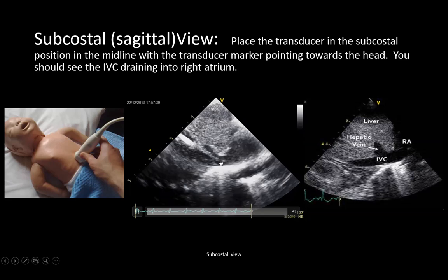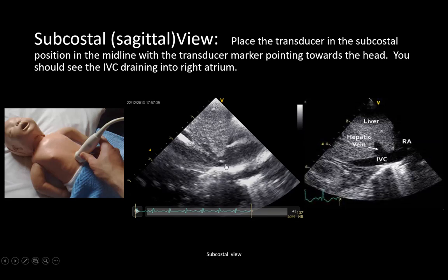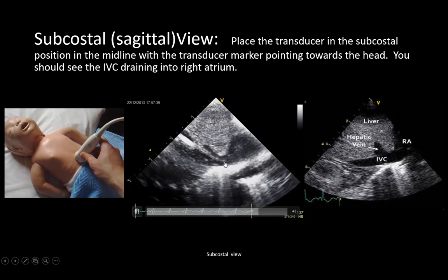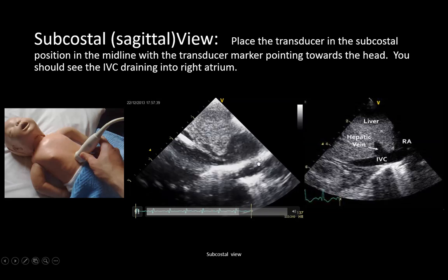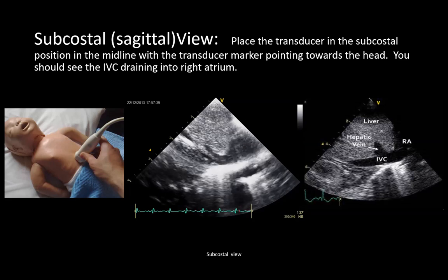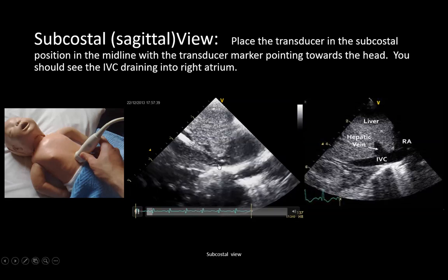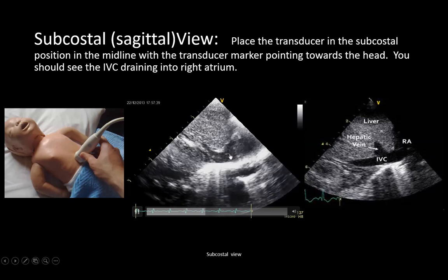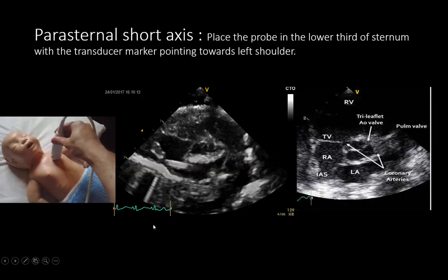Once we see the catheter tip entering the right atrium, we need to assess how far it has advanced — whether it is at the right atrial–IVC junction, approaching the inter-atrial septum, or crossing to the left atrium. If this is not clearly seen from the subcostal view alone, we proceed to the parasternal short axis view.